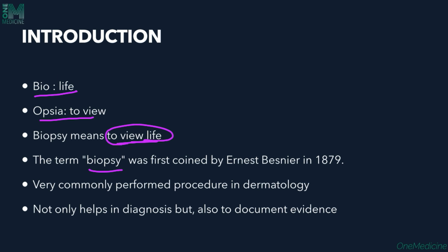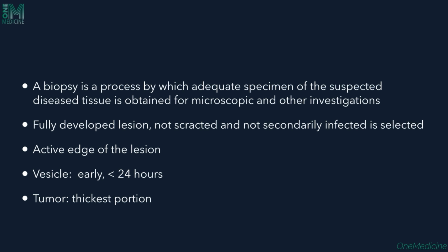It's a very commonly performed procedure in the field of dermatology. It not only helps in diagnosis but also helps to document evidence of the diseases. A biopsy is a process by which an adequate specimen of the suspected disease tissue is obtained for microscopic and other investigations. So, you obtain a part of the tissue or the whole tissue for coming to a final diagnosis, for the microscopic evaluation, and also for other investigations like direct immunofluorescence and so on.